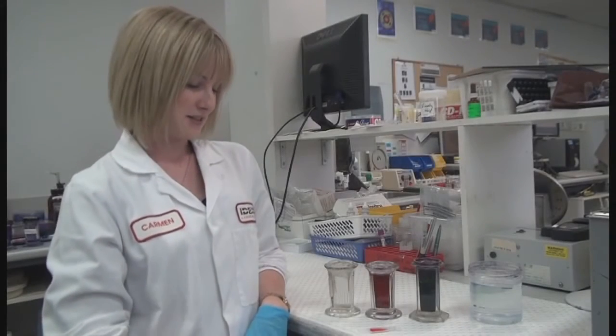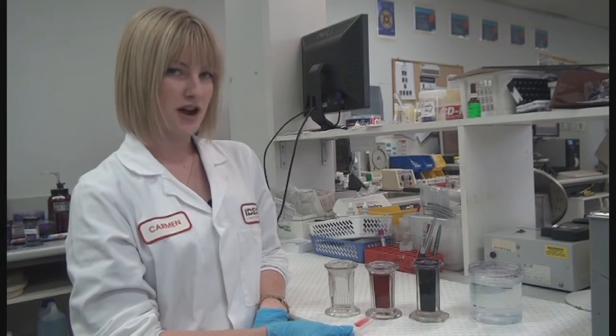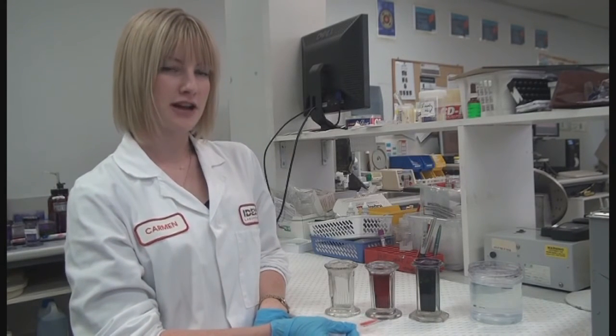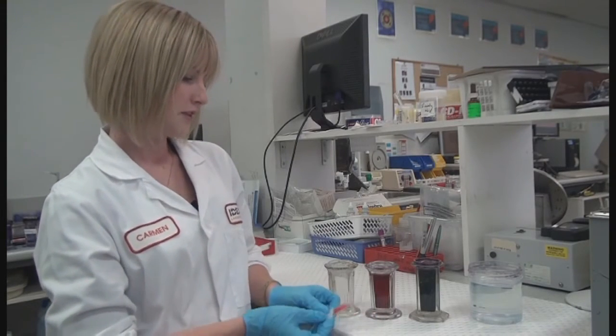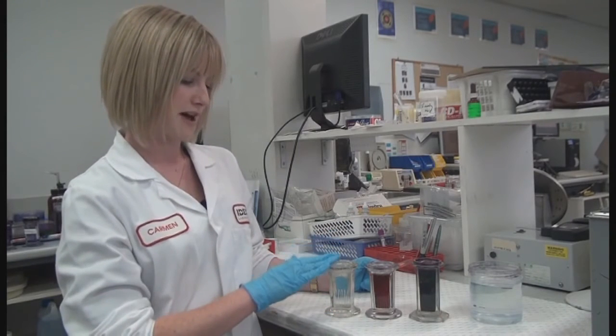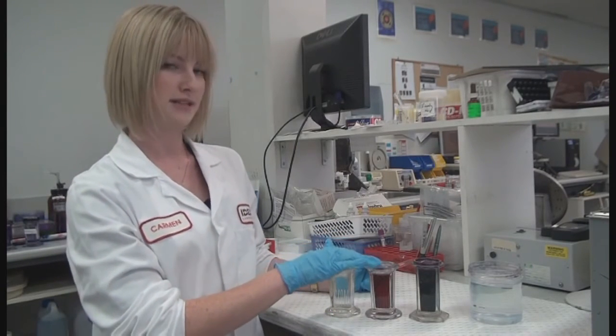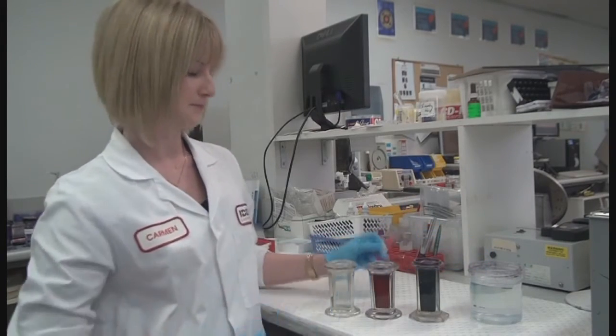So the next stage is to stain your smear. After you let it dry by air drying it or in front of a fan, but nothing with heat like a hairdryer, I'll show you the diff quick method of staining. So I've got my fixative, my quick dip 1 and quick dip 2, and then some rinsing water.